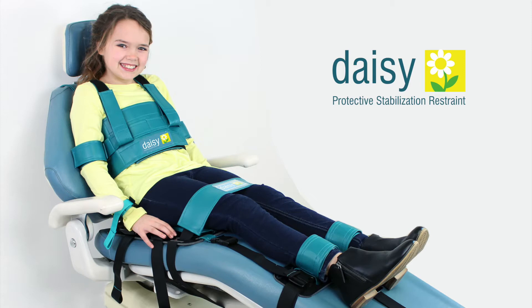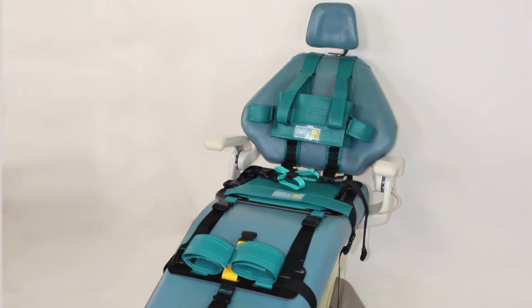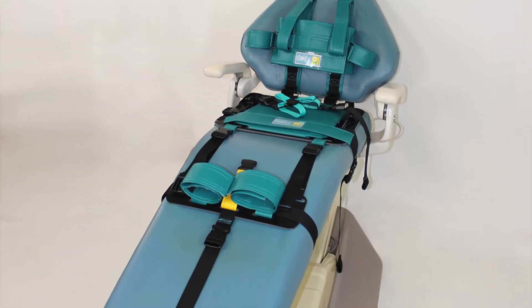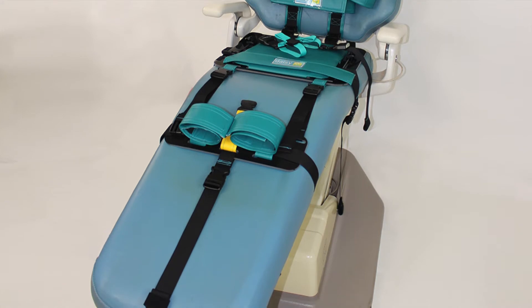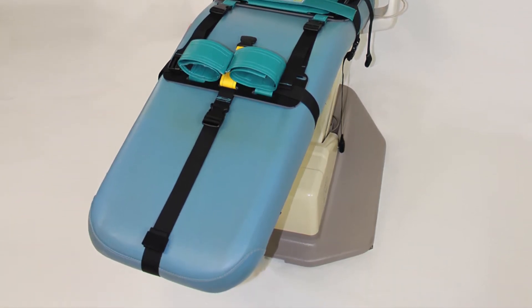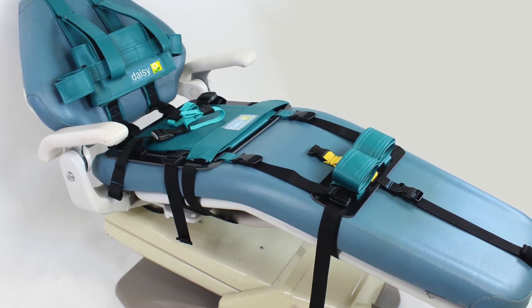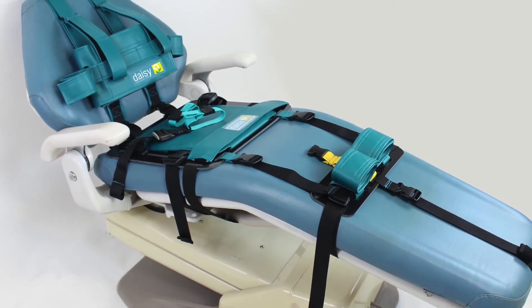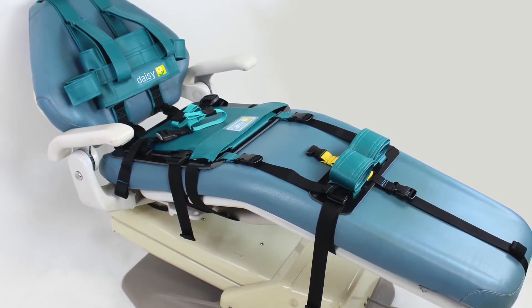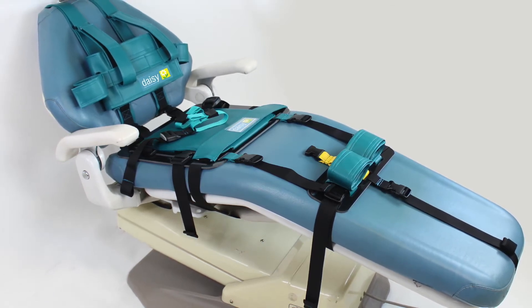There are a number of advantages to the DAISY PSR. The patient actually sits on the dental chair and not on a flat board, which provides the patient with greater comfort. For a young child, the DAISY is more acceptable to the child and caregiver because it is less threatening and looks a lot like a child's car seat. When installed, the PSR moves with the patient as the dental chair is adjusted. The strap-based system allows ventilation and is cooler for the patient. The DAISY is more stable when faced with a combative patient and does not rock or move out of position on the dental chair.